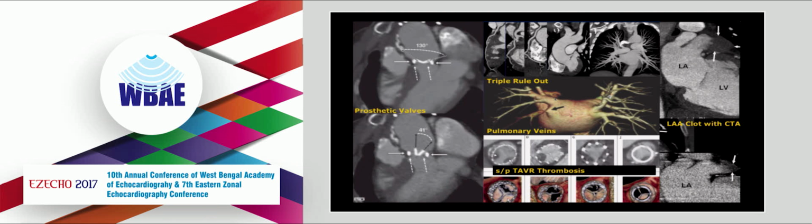Among electrophysiologic procedures, it has a lot of utility, and one of them could be diagnosing pulmonary vein stenosis after pulmonary vein ablations. Left atrial appendage is a useful indication. Here you can see when you give dye, there may be a clot in the LA appendage. The trouble with this is you don't know whether the dye did not yet reach this, or is this a real filling defect, and that's why we have to do a second scan a few minutes later, and then it shows the dye filling, yet there is a space occupying lesion consistent with LA clot.